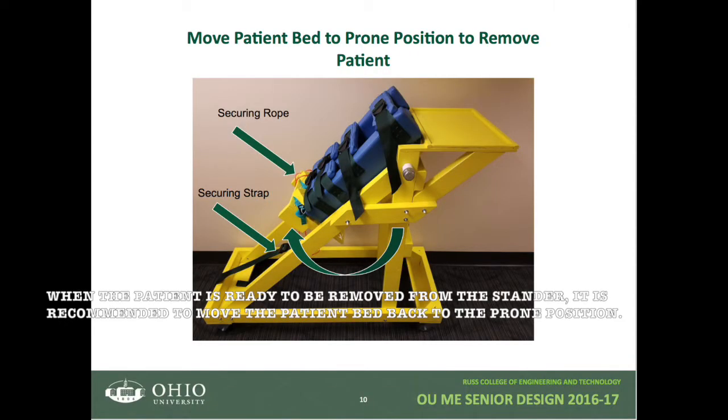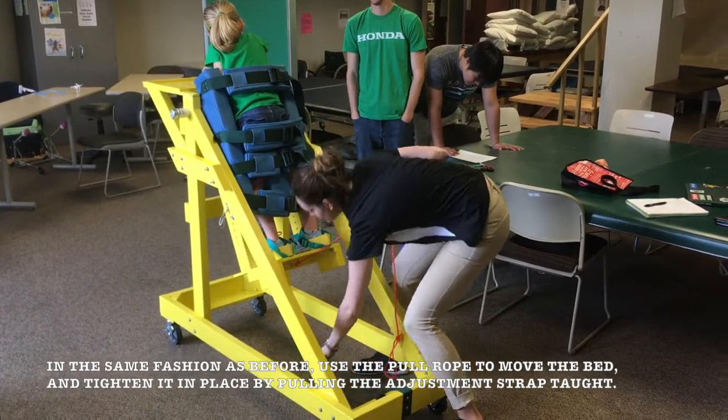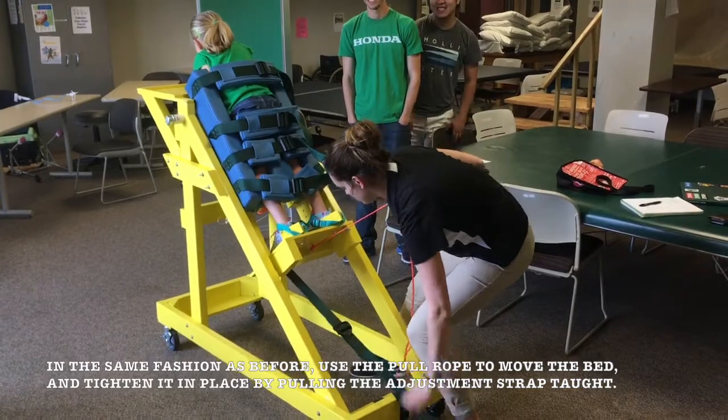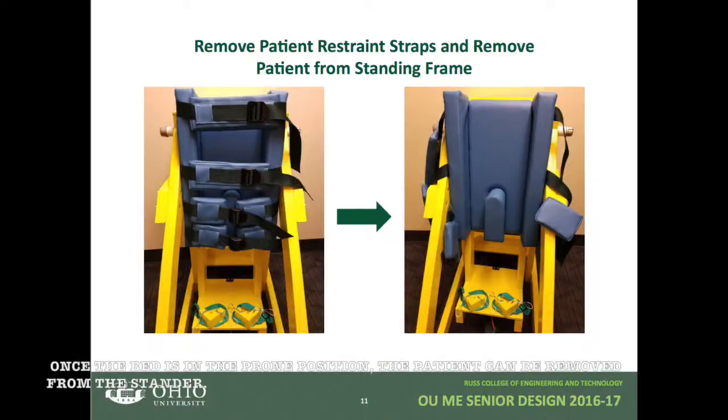When the patient is ready to be removed from the stander, it is recommended to move the patient bed back to the prone position. Use the pull rope to move the bed and tighten the bed in place by pulling the adjustment strap taut. Once the bed is in the prone position, the patient can now be removed from the stander.